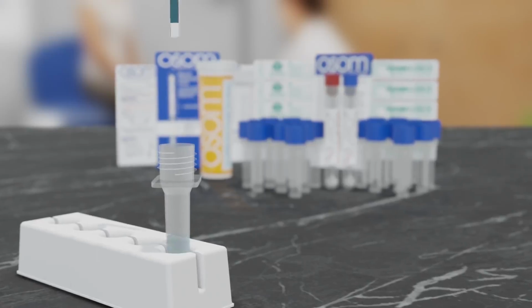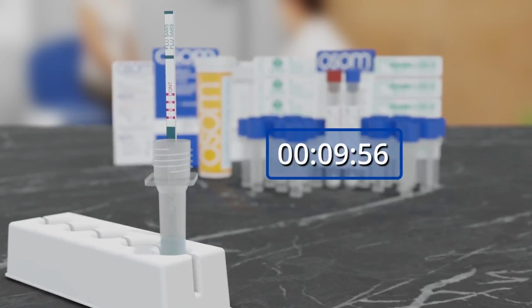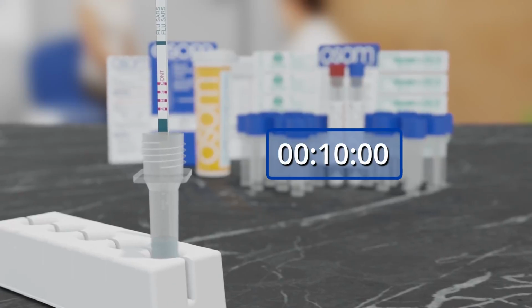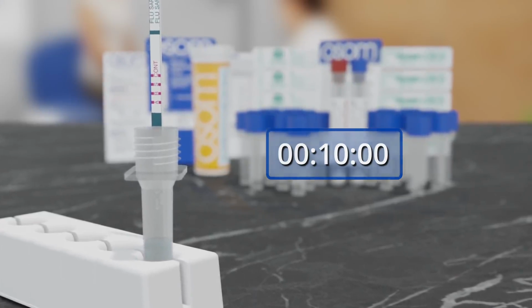Insert the test stick, arrows pointing downward, into the vial. Set a timer for 10 minutes. Leave the test stick in the vial for the full 10 minutes. Do not handle or remove for at least 10 minutes.